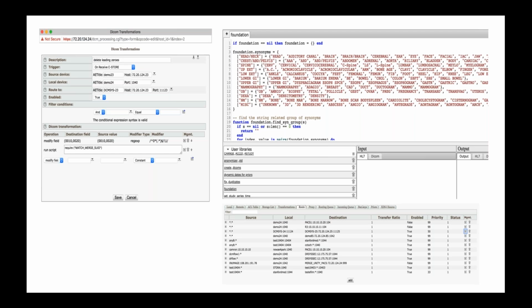Yeah, so we built a committee. Knowing that we have inconsistent procedure description data, and knowing that most of our customers were not using the body part flag within the Dicom header, we sat down with them and said, let's look at the universe of procedure descriptions that we're receiving, and let's come up with a list of synonyms inside of that description that might mean head. So for head, you might see brain, you might see neck, whatever. And we came up with those various synonyms.